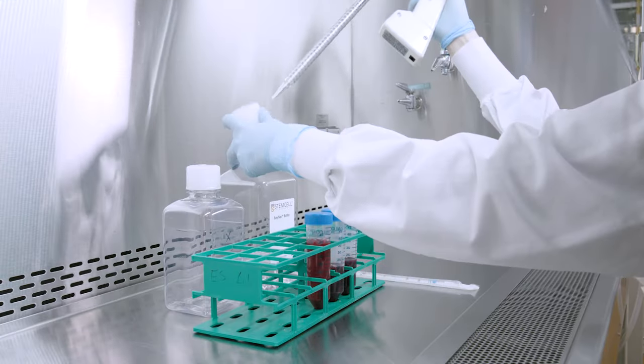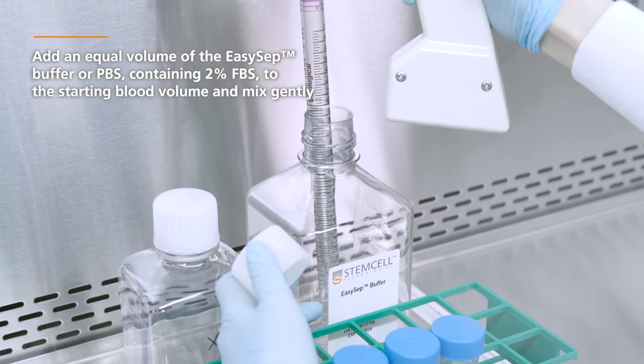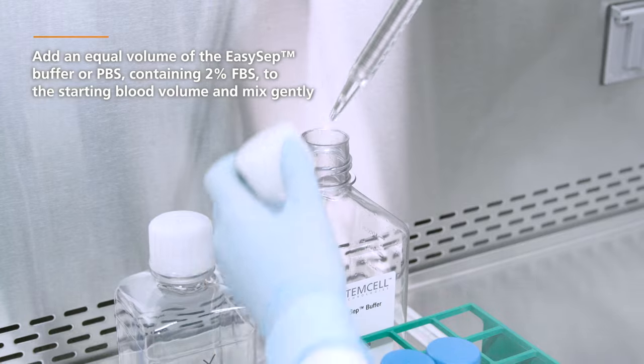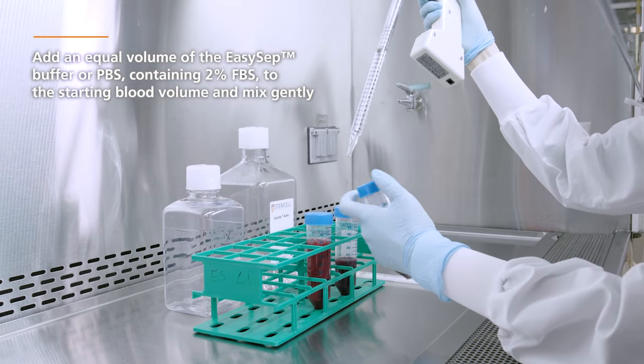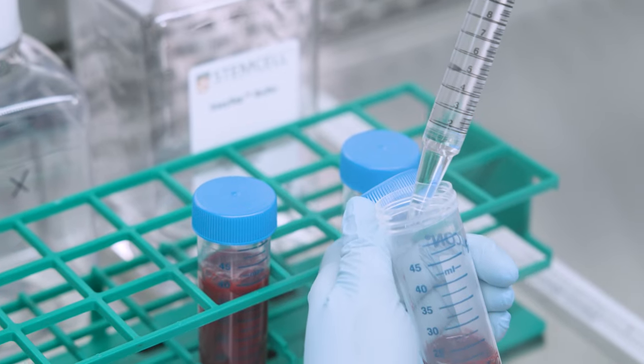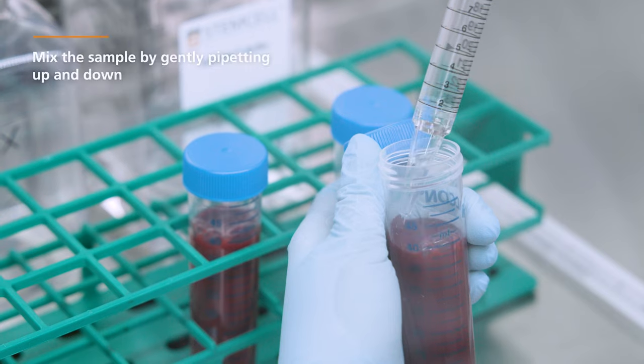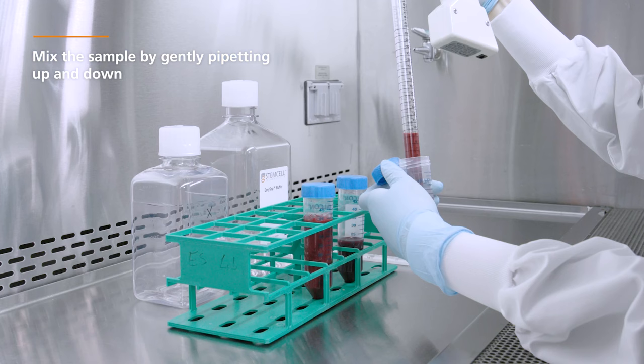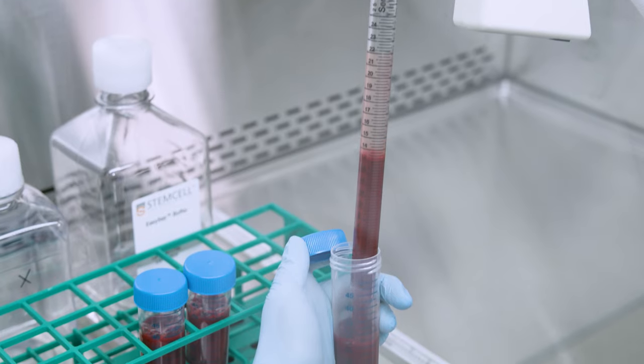In a biological safety cabinet, add an equal volume of the EasySep buffer, or PBS, containing 2% FBS to the starting blood volume, and mix gently. For example, add 20 mL of buffer to a 20 mL whole blood sample. Mix the sample by gently pipetting up and down 3 times using a 25 mL serological pipette.